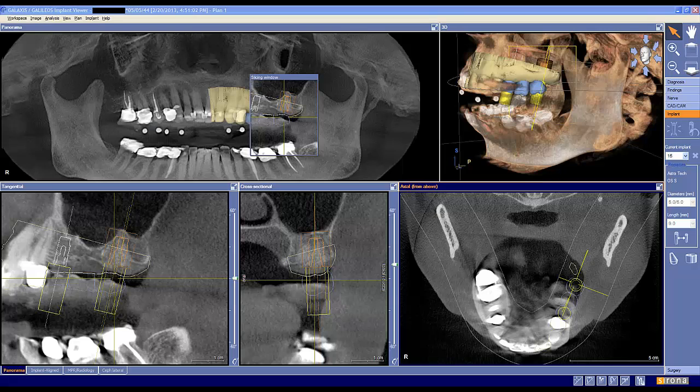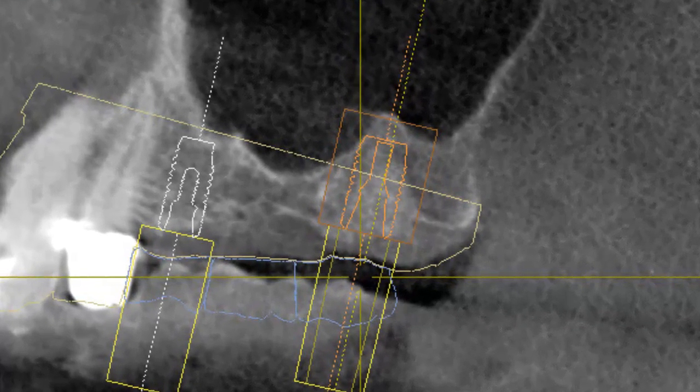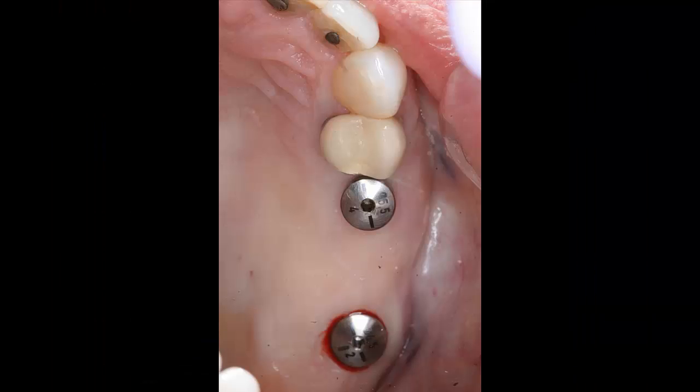Planning for the implant locations and construction of the surgical guide was done virtually and deliberately to skirt the maxillary sinus, thereby simplifying the surgery and reducing healing time and expense.